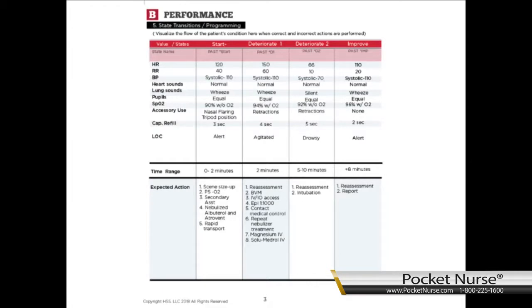At the core are the pre-programmed scenarios, and this shows one scenario. Typically the scenarios will have a start position, and then the patient will automatically deteriorate, or the instructor can set the deterioration, and then based on expected actions the patient will improve or further deteriorate. The system comes with a binder with all the scenarios and instructions for setup included in that binder. Now let's take a look at the operations of the scenario itself.